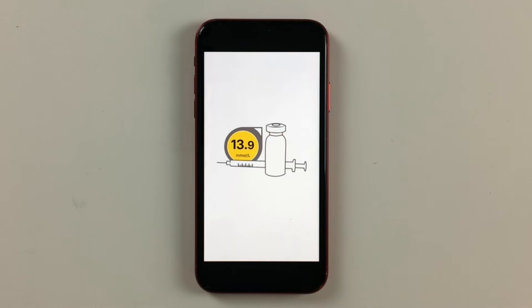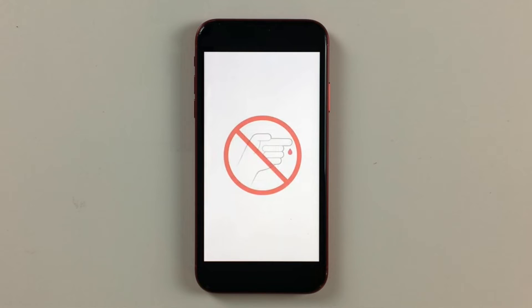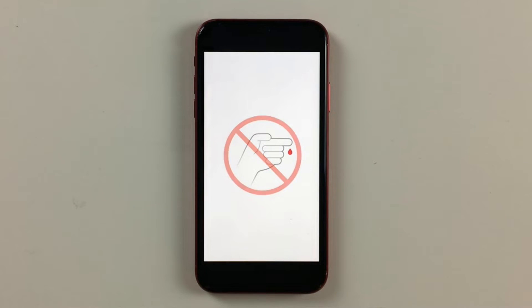I did my Dexcom G6 site change a couple days ago and I thought I would film it and do a quick step-by-step tutorial video. This tutorial is for those of you who already have the Dexcom G6 app installed on your phone. If you don't have the app yet, check this video where I explain how to do it step by step. But now, two minutes on the clock — let's apply the G6 sensor.